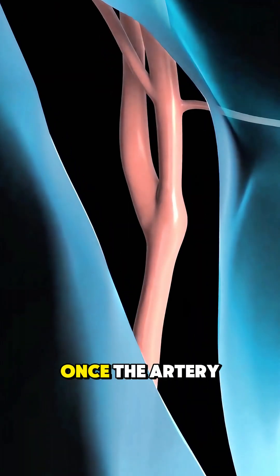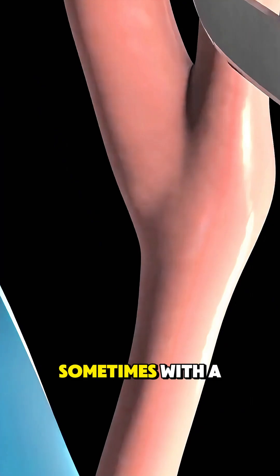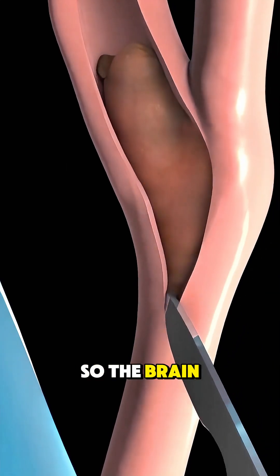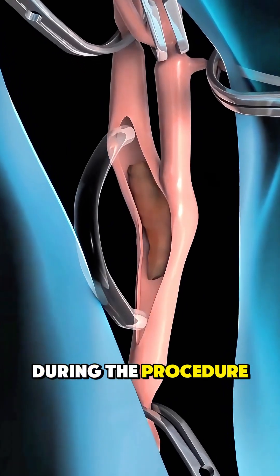Once the artery is exposed, blood flow is safely managed — sometimes with a temporary bypass — so the brain still gets oxygen-rich blood during the procedure.